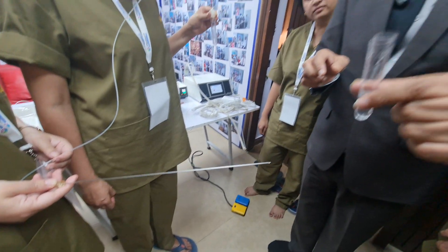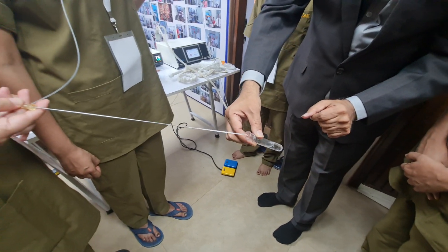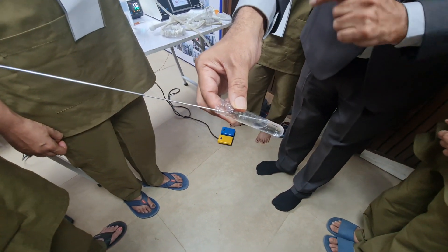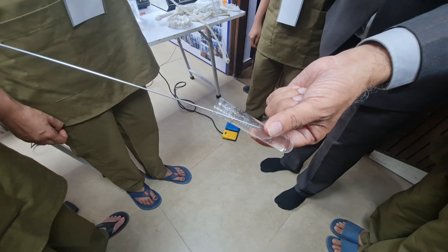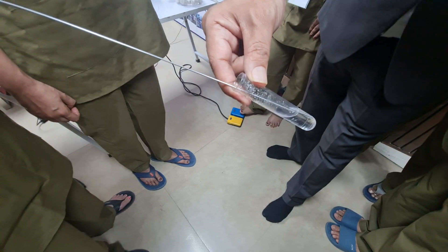So this is my needle. I'm going in like this, and when I tell you, press the blue button. All of you, watch what happens here — now press.